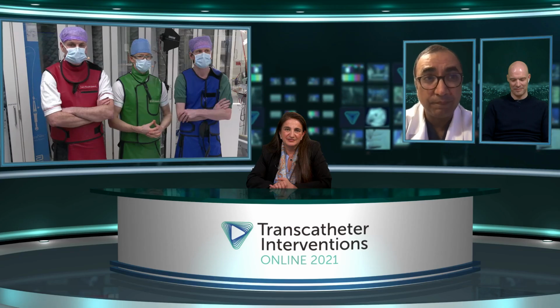I like the mechanism of this device, of how you kind of push forward to expand it more, to get it to anchor better and really conform to the anatomy. So great demonstration also of using ICE. I certainly would love to see how this procedure evolves when we have 4D ICE catheters readily available.